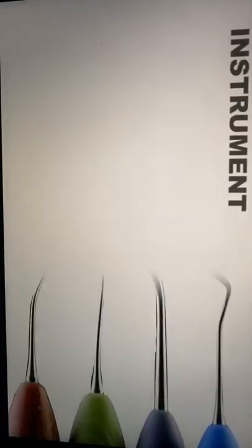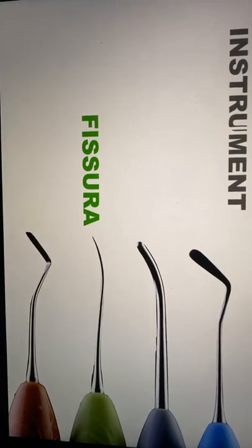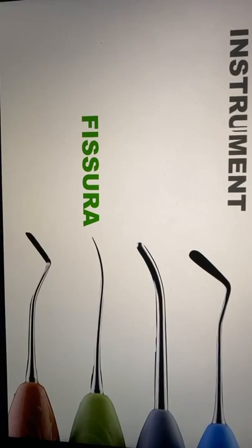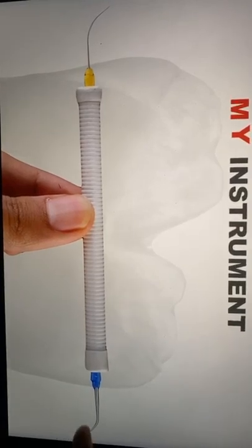So for me, the very first time I used this instrument, this one is from LMR, as I already said, the green one, Fissura. This is a very sharp instrument. I like it. But my fissures' character is a bit more sharp. I have very deep and sharp fissures, so I wanted to create my own custom instrument that is really, really sharp, which I can use to simplify my carving. So that's why I created my own instrument here. This is my instrument. I created it by myself.